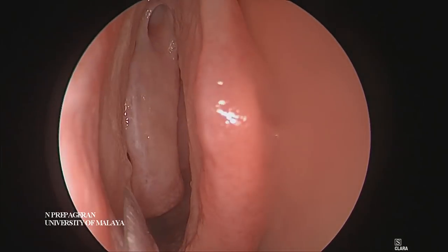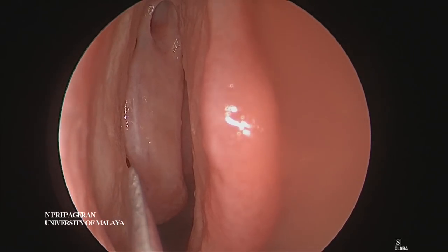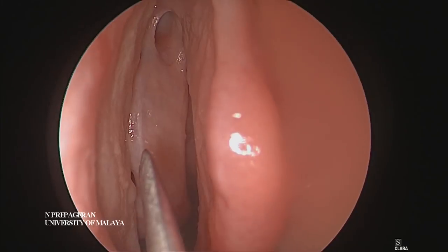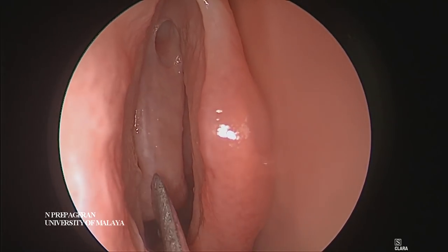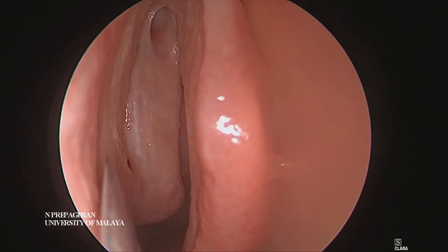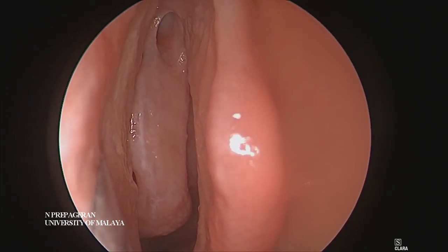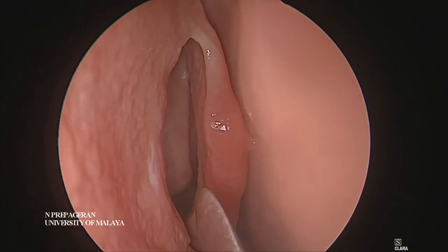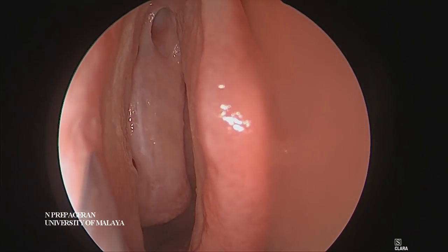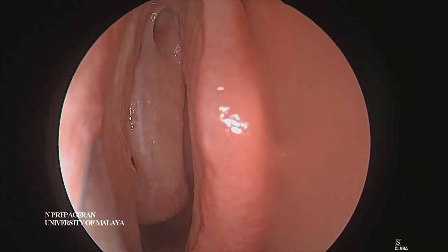So step number one is to do an uncinectomy. There are a few ways of doing an uncinectomy. We can do an anterograde uncinectomy, which is front to back, or retrograde uncinectomy, which is back to front. Usually, if the uncinate is well-formed, I like to do an anterograde uncinectomy. So in this case, I will show you how we do an anterograde uncinectomy on this side, and I'll show you how to do a retrograde uncinectomy on the opposite side.